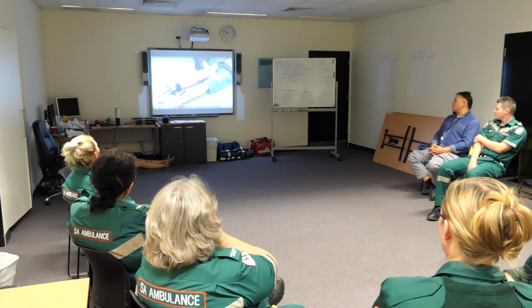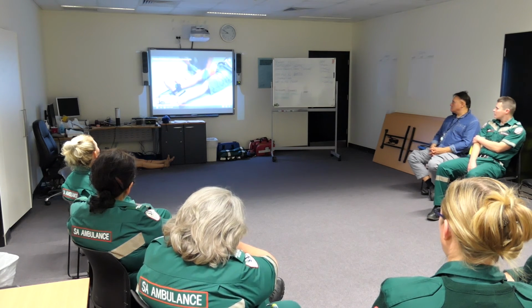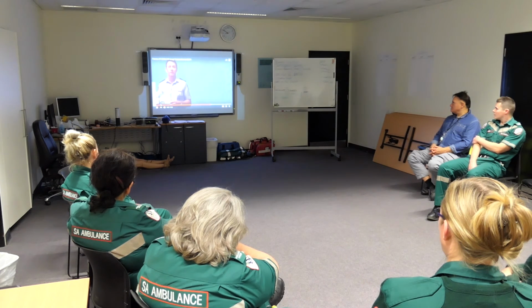Step 9. Securing and applying traction. The first strap is placed around the upper inner thigh, ideally above the fracture. The second strap is wrapped above the knee, ideally below the fracture. The third strap is placed below the knee, and the fourth strap is placed directly above the ankle hitch. Now, apply traction as required by readjusting the tension until the patient's comfort is achieved.